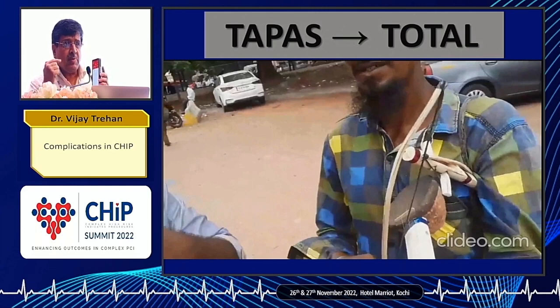This thrombosuction device is just like a single string, a single wire. If you have learned the art, you can play music. If you have not learned the art, then this thing becomes like ching, ching, ching, ching, and that 25-30 rupees is wasted.